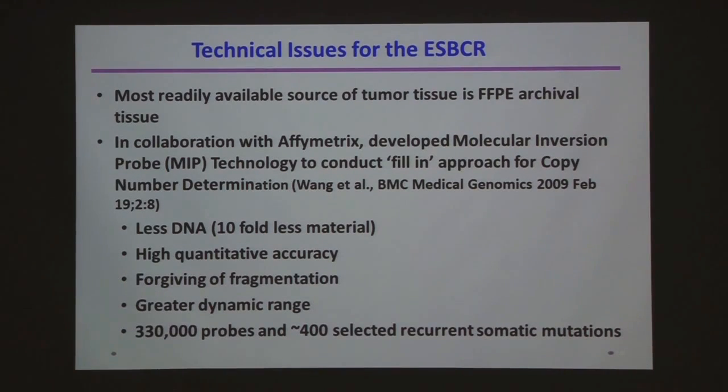It was built working with people who were studying breast and ovarian cancer, the Stand Up to Cancer group, and Affymetrix worked with them very closely for the new version of the OncoScan to incorporate most of the known genes that are important for breast and ovary, but also for other cancers as well. So we think that the mutations that are now included in version 3 are much better than the mutations that are here.